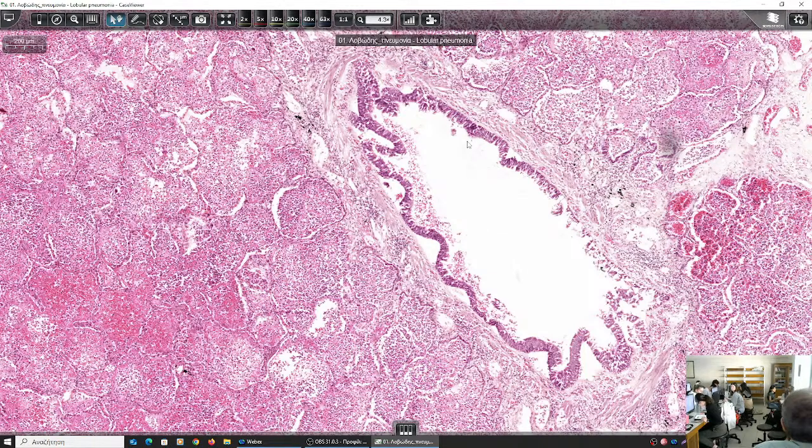And now, can you tell me what this glandular structure is called when it is encountered in the lung? What glandular structures do we find in the lung parenchyma, in the lower respiratory system? What can this be? Remember from histology? Yes, please? The bronchus. This is a bronchus. Yes, and it is quite a big one.